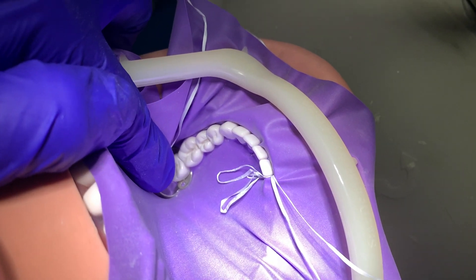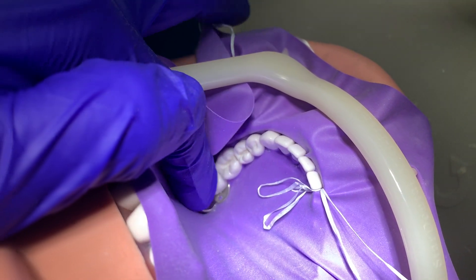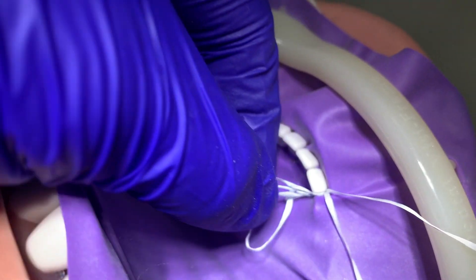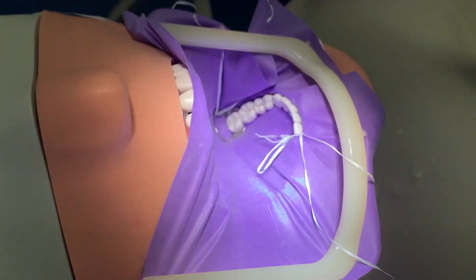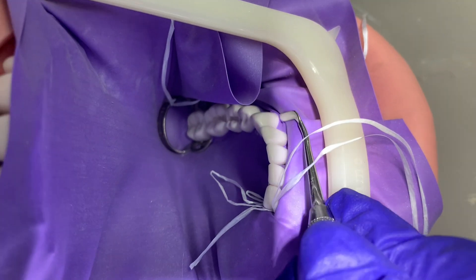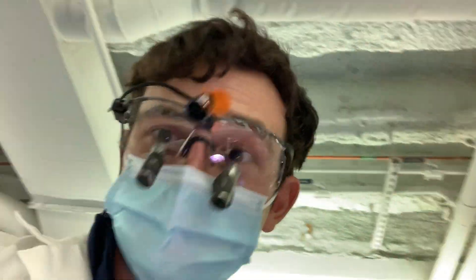Once we put the clamp on, we got our rubber dam with holes punched in. We threaded it through tooth number 18 first, then went to number 26, put it around that, and then did a double floss to keep it in place. Then we started pushing every tooth through. Here's the final result — it's pretty good. Dexter is going to push down and tuck the part that's sticking up into the surface. Looking good.